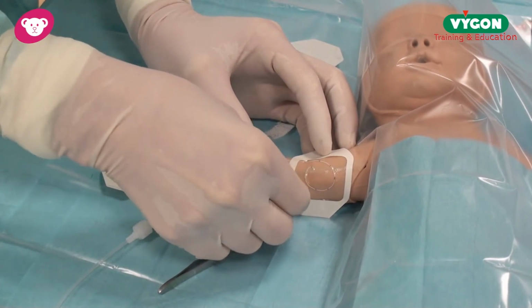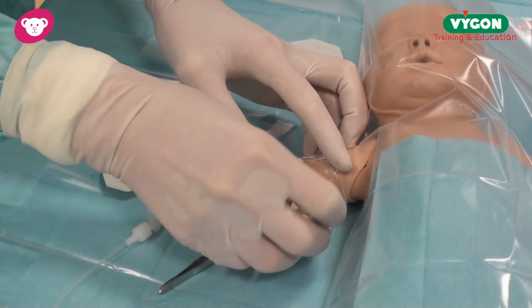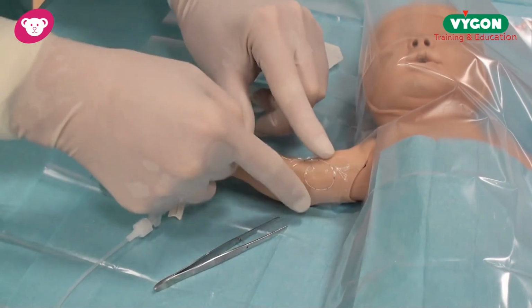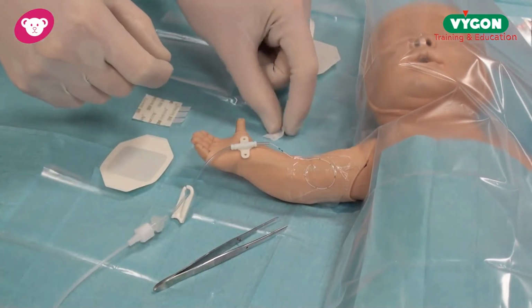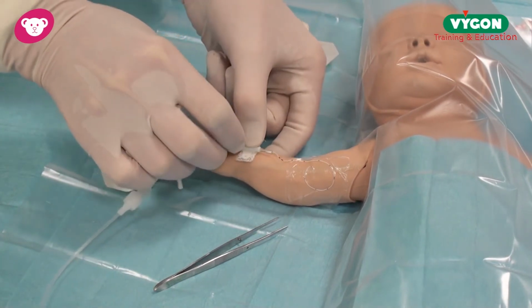Now, with this type of dressing, we can actually see very nicely the entry site, and we can monitor for any blood loss, and it secures the catheter very, very nicely. The next important procedure is to stabilize the wing of the catheter, and in this case I make sure I have a dressing like so.